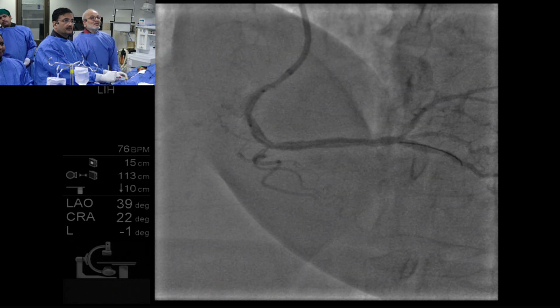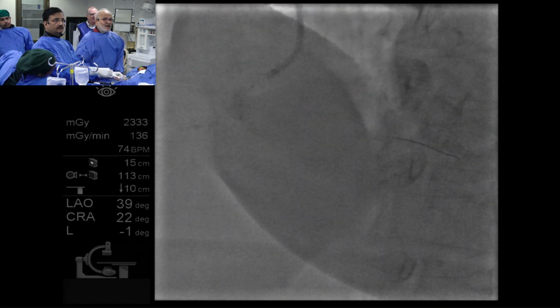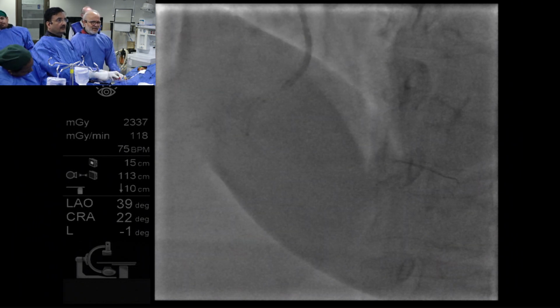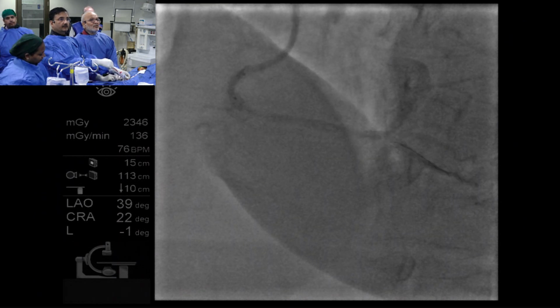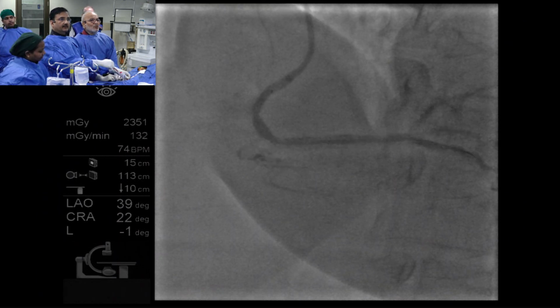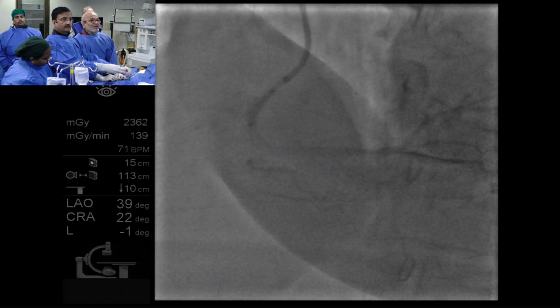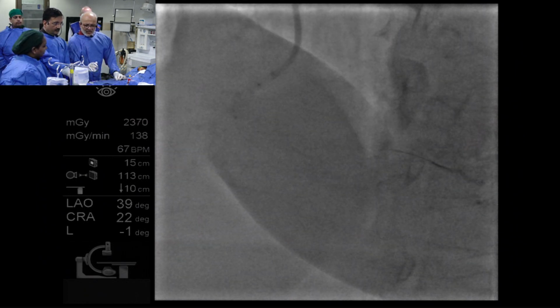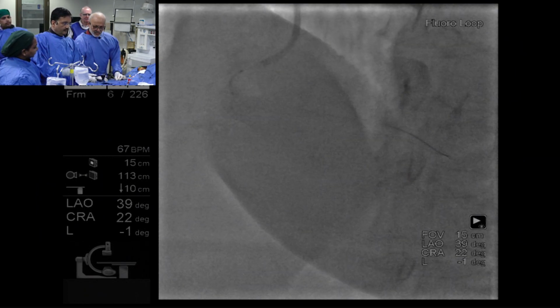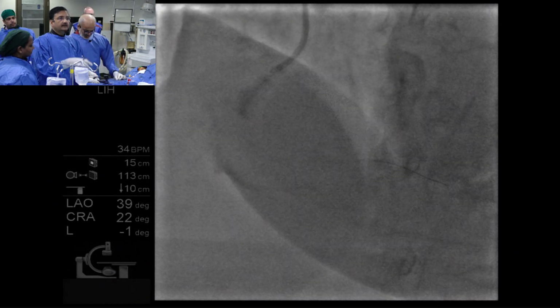Smooth. It's moving, yeah. So we have to be very quick. Check it. Go. Payal, go. Quick. Quick. 10, 12, 14, 15, 18. It is over. Wait. This is that Nipro device. 18.